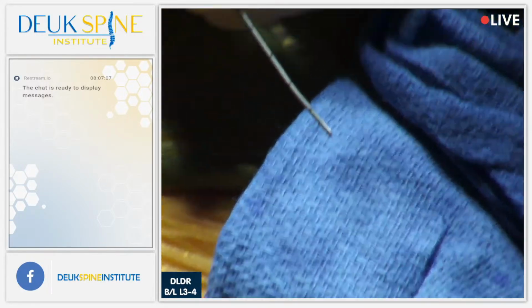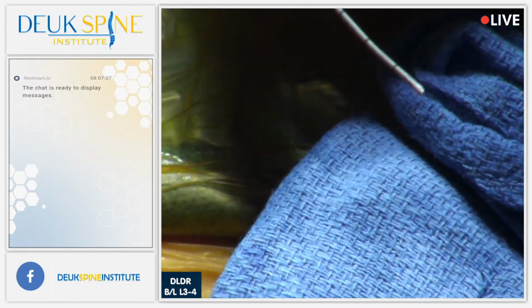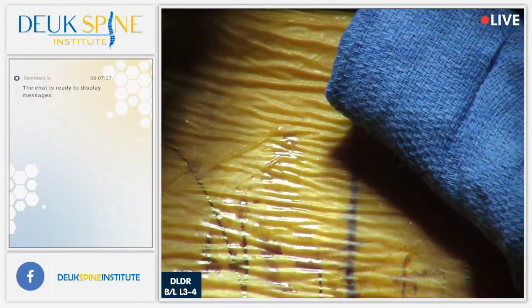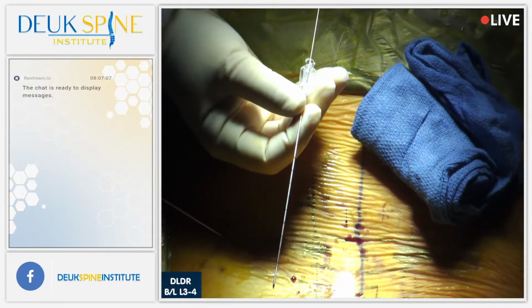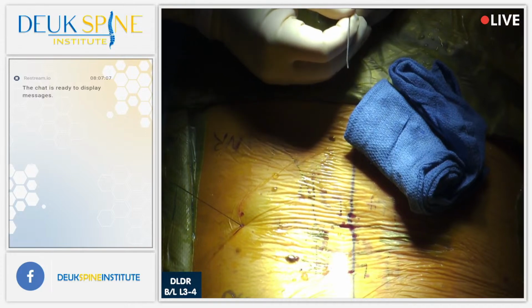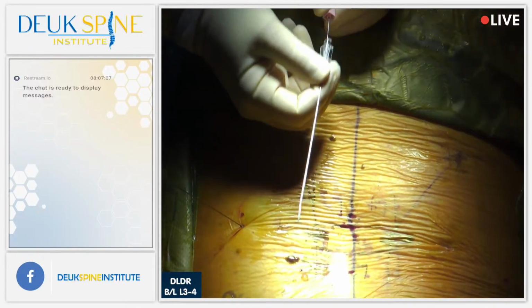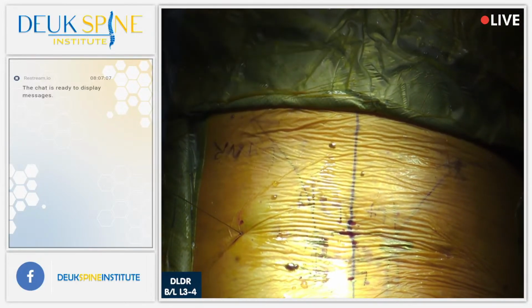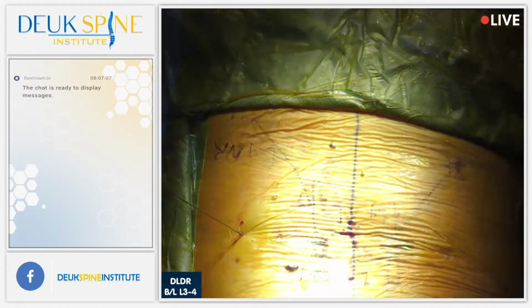So if you're not careful, you could actually melt through, and the stylet, which is this thing right here, you guys see this going in? That stylet right there? Yes, we do. That's inside the needle. If you're not careful and you hit it with the laser, you'll literally weld those 2 pieces of metal together, and then you'll have to start over. And I've done that once before, I think.